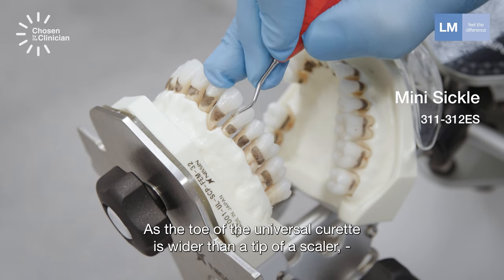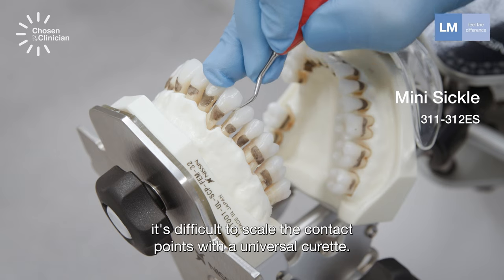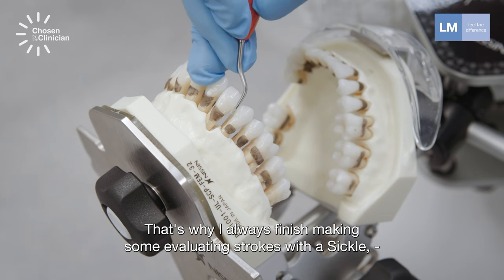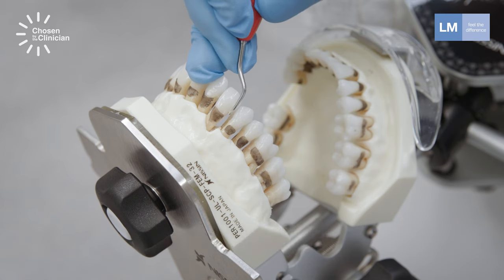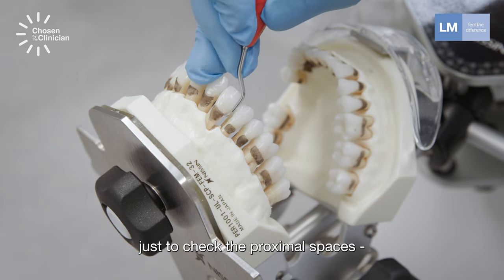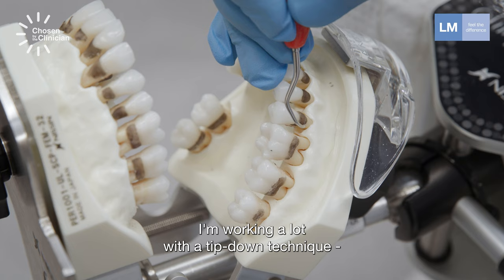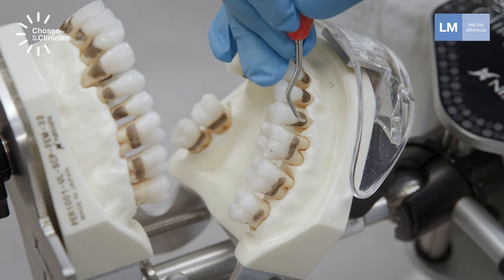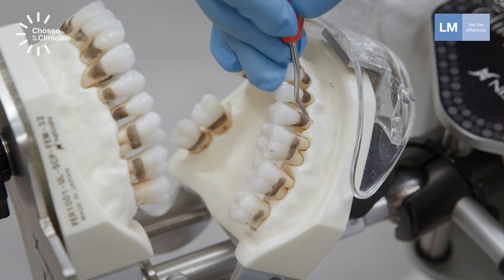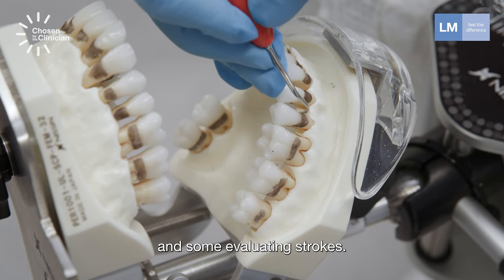As the toe of the universal curette is wider than the tip of a sickle, it's difficult to scale the contact points with the universal curette. That's why I always finish and make some evaluating strokes with a sickle. In this case, the mini sickle is a very good instrument — just checking the proximal spaces for any pearls of calculus left. I'm working a lot with a tip-down technique for finishing strokes, making a combination of detecting strokes and some evaluating strokes.